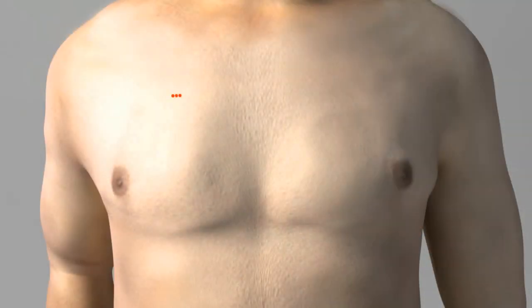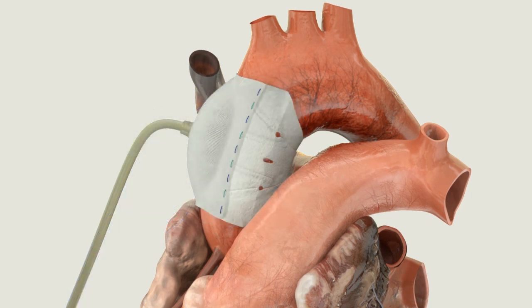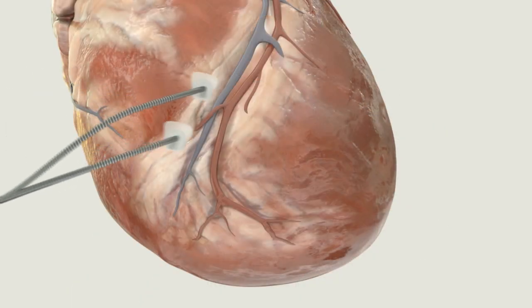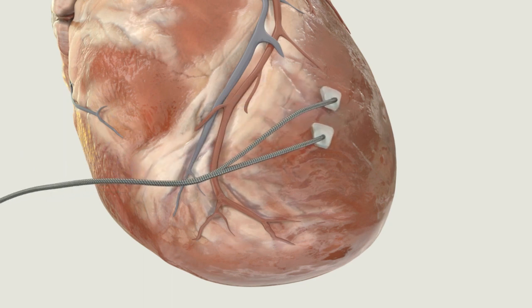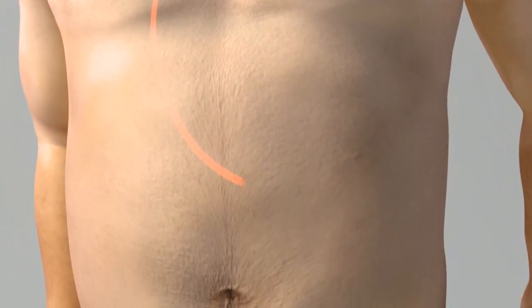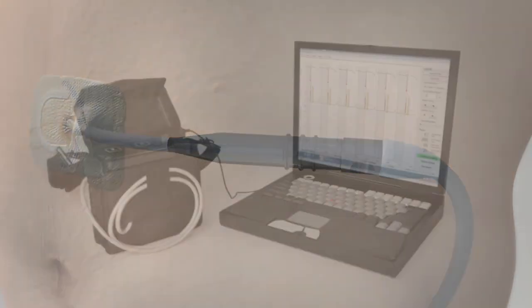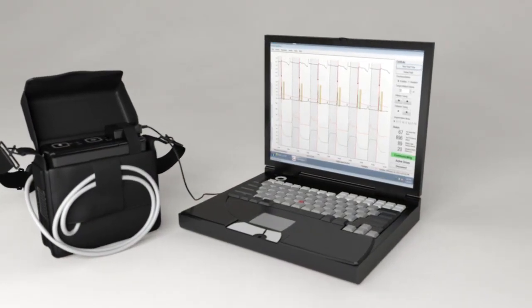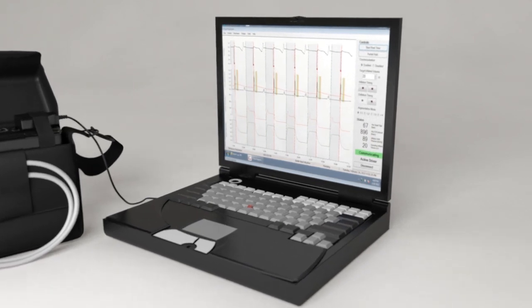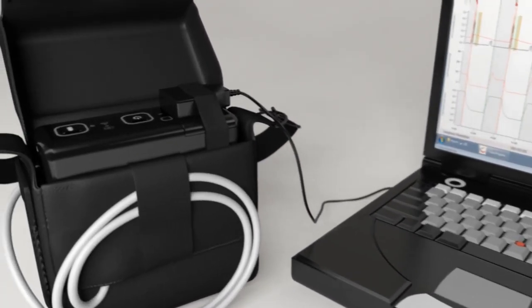The C-Pulse Heart Assist device may be placed through a right-sided mini-thoracotomy or by performing a partial or full sternotomy. The C-Pulse cuff is then placed around the ascending aorta, above the aortic valve. Epicardial sensing electrodes are then attached to the ventricle and are verified to produce good signal sensing. Both the sensing lead and the cuff gas line are connected to the percutaneous interface lead and then tunneled down and brought out through an exit site in the abdominal area and attached to the driver. A dedicated C-Pulse programmer is used to adjust timing settings to have the balloon inflated after LV ejection and the closing of the aortic valve, and to ensure the balloon deflates prior to the start of LV ejection.